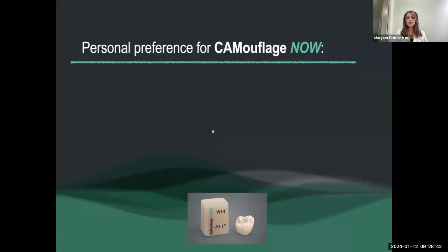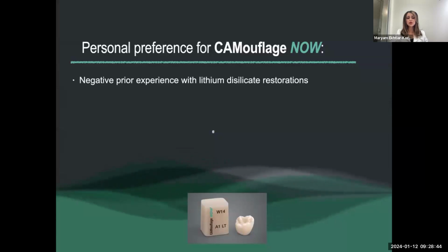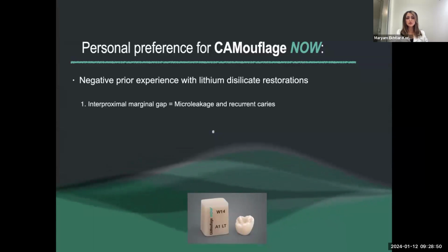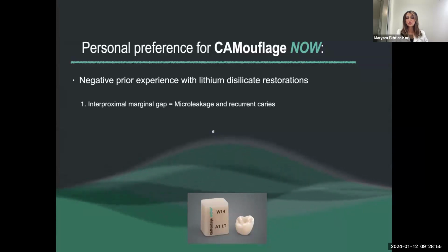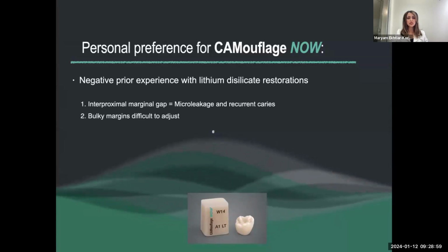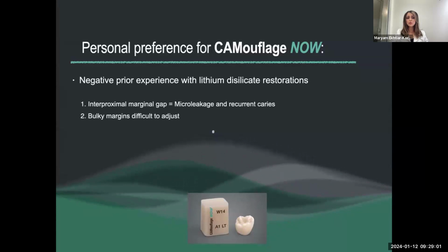So my personal preference is Camouflage Now. Honestly, I've had negative prior experiences with lithium disilicate restorations. There have been interproximal marginal gaps, which have led to microleakage and recurrent caries. The margins are bulky and difficult to adjust.